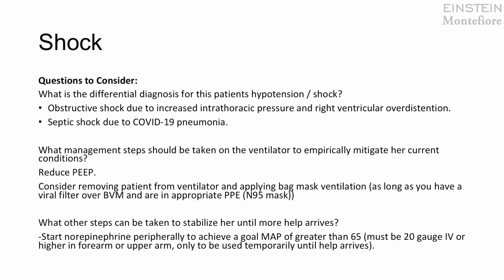on the right ventricle. Sometimes in the ICU what we do is we actually do a point-of-care echocardiogram and we can see if the right ventricle looks over-distended, whereby it's at least bigger than the size of the left ventricle. We often don't have this luxury in patients outside of the ICU or where an ultrasound isn't available. So the first thing you'd want to do is possibly, if the patient can tolerate it from an oxygenation standpoint, would be to lower the PEEP.